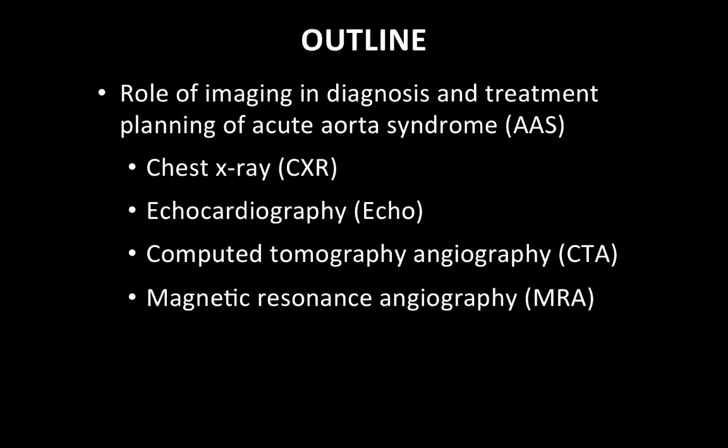Today I will be covering the role of imaging in the diagnosis and treatment planning of acute aortic syndrome, specifically talking about the role of chest x-rays, echocardiography, computed tomography, angiography, and magnetic resonance angiography in the workup of patients suspected of or known to have acute aortic syndromes.